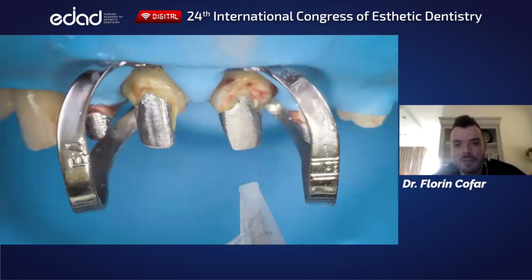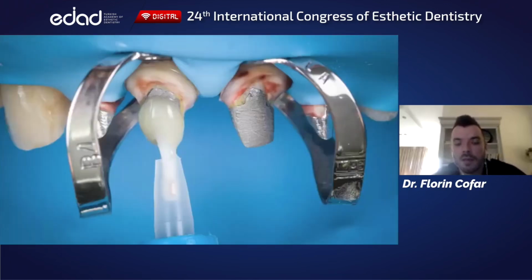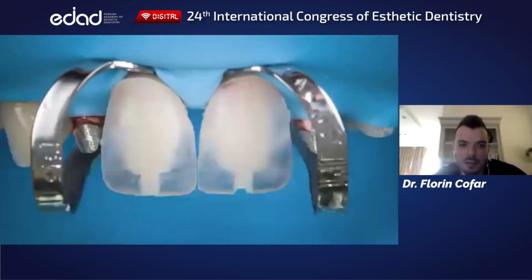We're going to sandblast, silane that metal, and then you're going to etch, bond. And here it's like an opaque resin that I found in the lab. I don't really know what system it is. It doesn't matter as long as it's white, just to block that metal. It does the job.